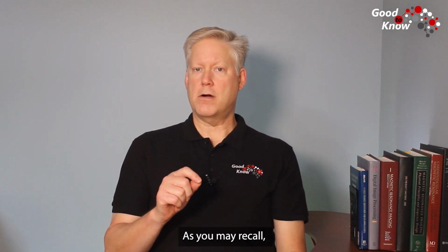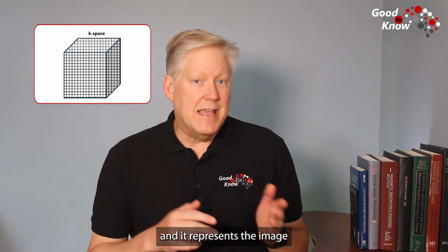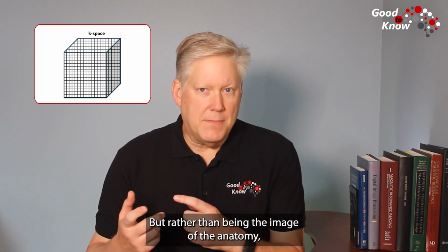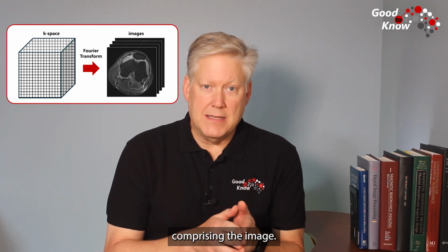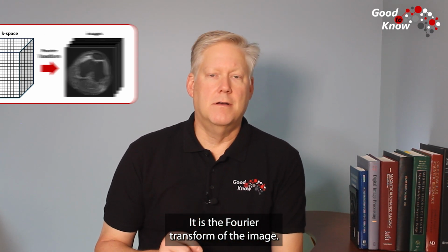As you may recall, k-space is a 3-dimensional matrix of data that's acquired during an MR scan, and it represents the image to be reconstructed. But rather than being the image of the anatomy, k-space is the corresponding frequency information comprising the image. It is the Fourier transform of the image.